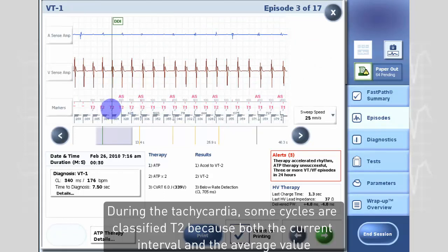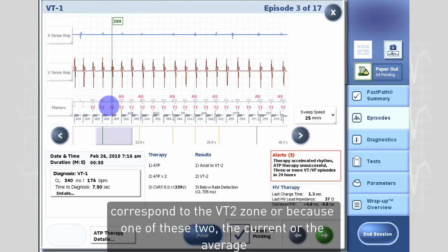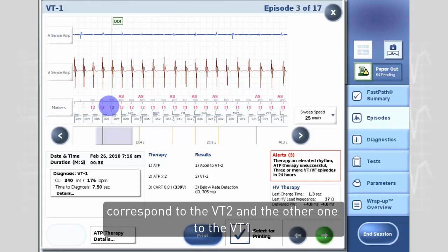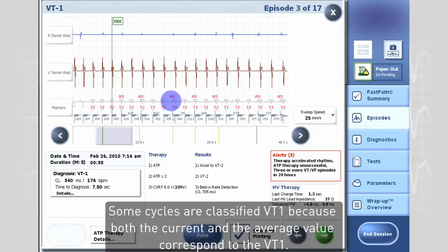During the tachycardia some cycles are classified T2 because both the current interval and the average value correspond to the VT2 zone, or because one of these two, the current or the average, correspond to the VT2 and the other one to the VT1. Some cycles are classified VT1 because both the current and the average value correspond to the VT1.